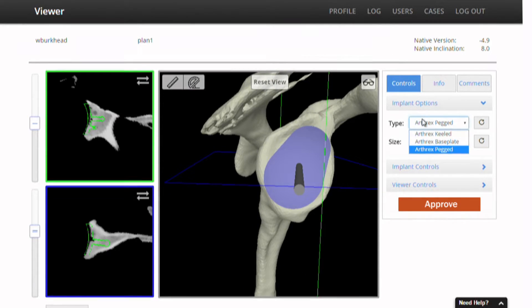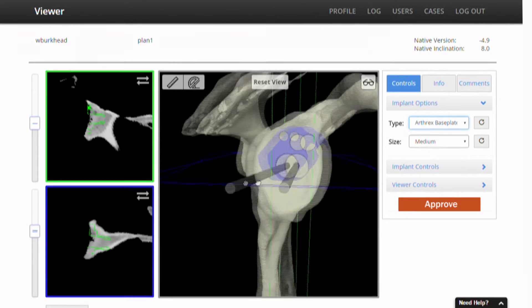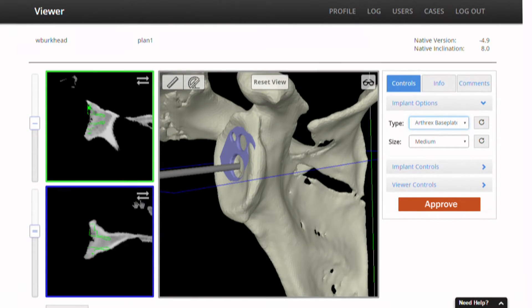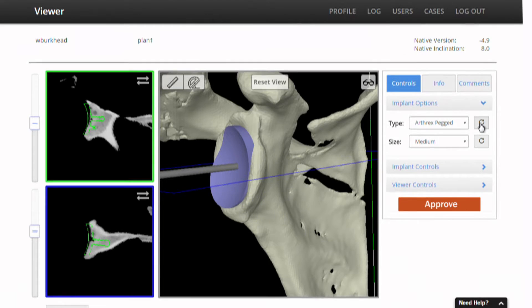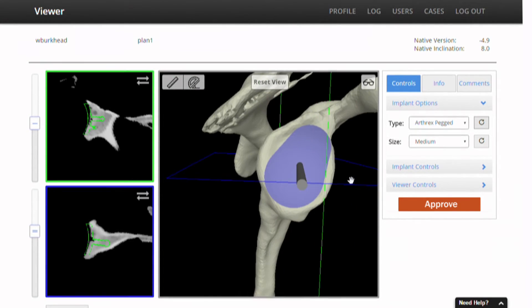These are pretty much real-time changes that you're seeing. If you're doing a reverse, this is what a reverse component would look like — obviously you would put it in a very different position. So let's go back to the planned component, which is a pegged glenoid component, and I agree with the planners that a medium is the right size.